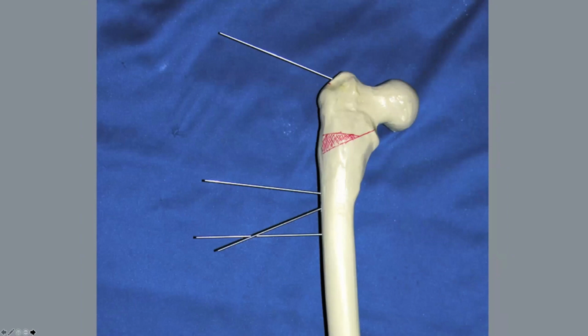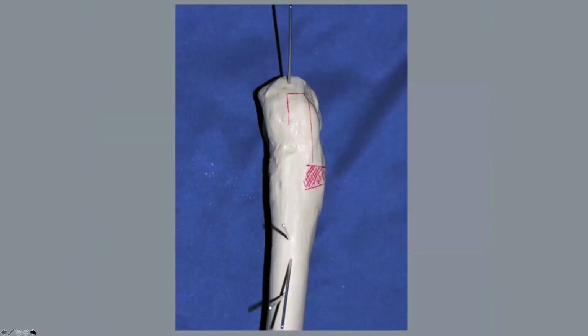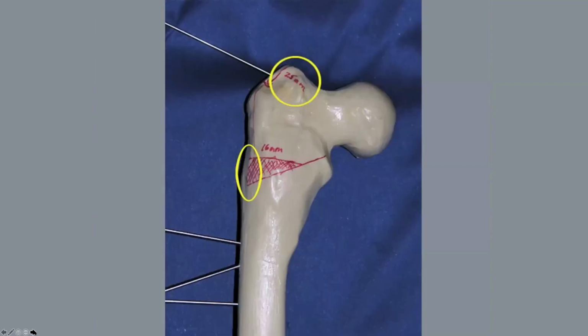Intraoperatively, you're not going to make a drawing like this, right? You're not going to draw over the anterior cortex, but you can draw over the lateral cortex that you're looking at and give yourself an idea of where your wedge is going to be, how big that wedge is going to be, like how far down from the trochanter is going to be where your blade plate seating chisel goes. You can make that mark, and then how large the lateral cortex wedge is. And you can make a little mark there as well with a small sharp chisel.